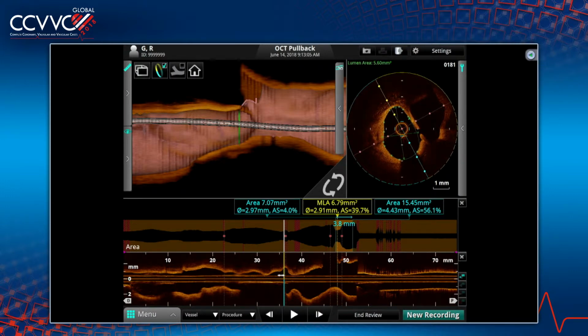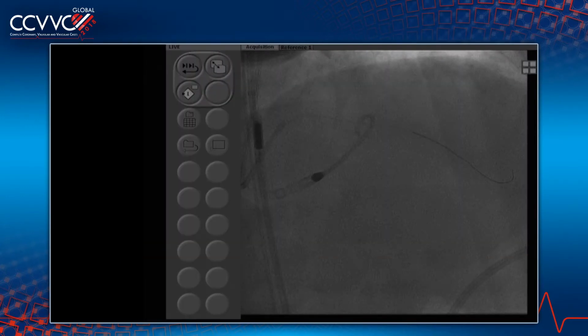Antonio, did you have a comment? You see all these things only during meetings and not in real life. The other point is the old rule is that you make your decision up front. If you want to treat, in general, you go for imaging. If you don't want to treat, you go for FFR. That's an interesting concept, Antonio. That's a very good point, but in this case, imaging didn't help us.